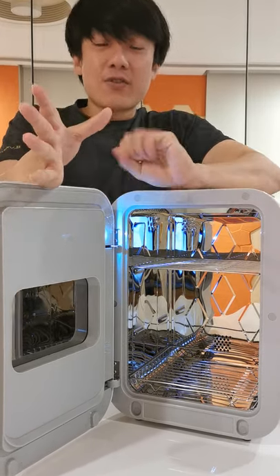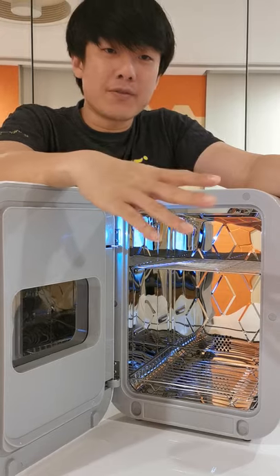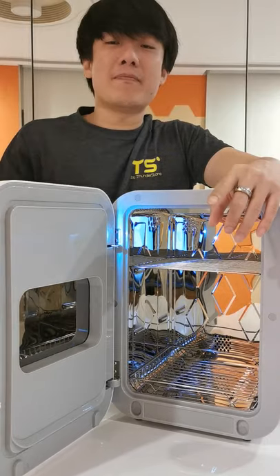As for things that you can sterilize, there are a lot of things you can sterilize. You can sterilize toys, bottles, and handphone masks. Basically, this is a less messy method as compared to the steam method.